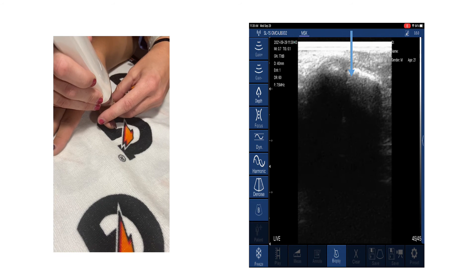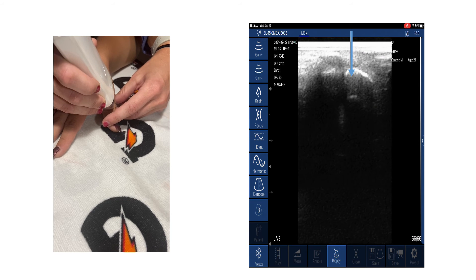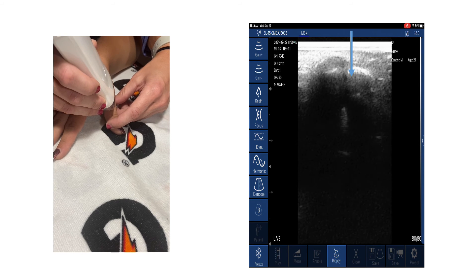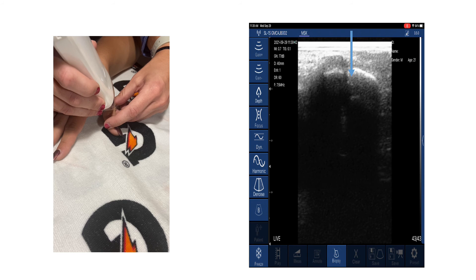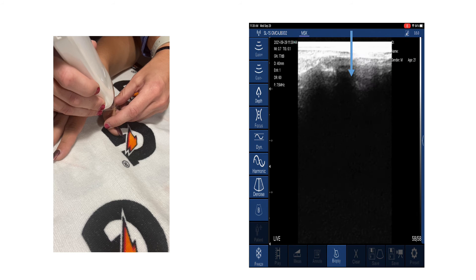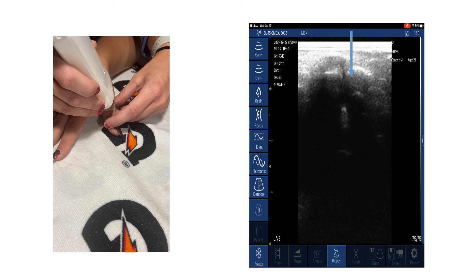An advantage of diagnostic ultrasound is the ability to add dynamic movement to continue to assess the integrity of the ligament. The examiner can apply a valgus force to the joint, which can be seen in the video while the joint space separates, but the ligament tightens to resist the valgus force.